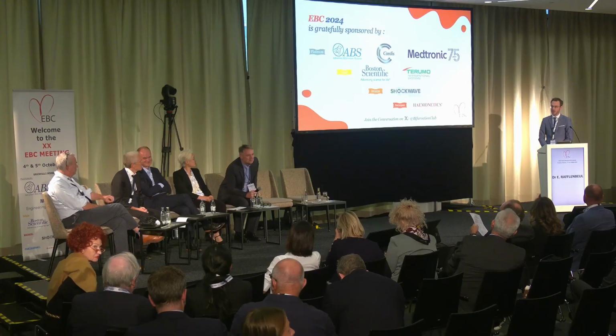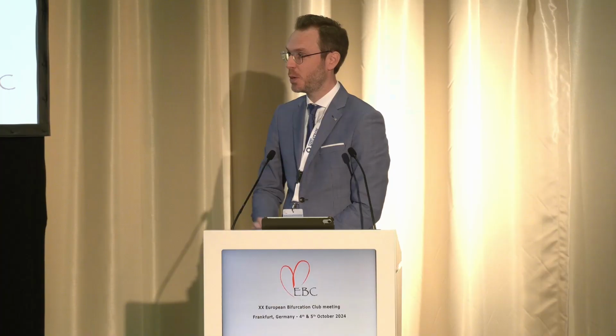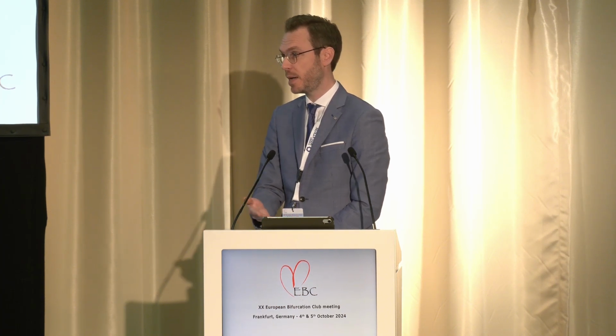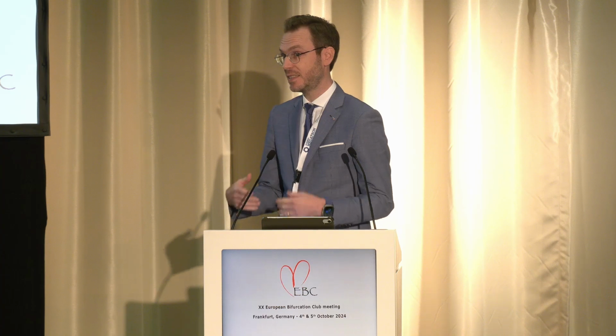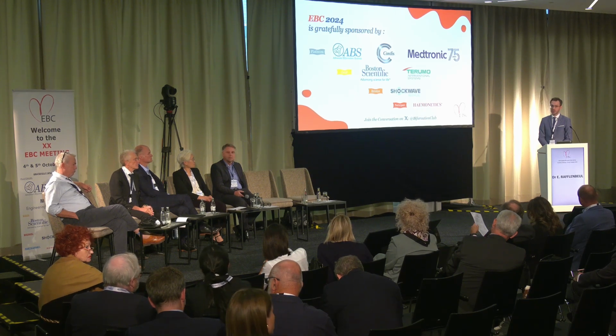So I don't think that we have to stent. We have data coming from the area from Eun-Seok, where we had a lot of dissections and the dissections heal. And this minor dissection, which is a type B, type 2 dissection, with no flow limitation, doesn't push me to put a stent inside, because the main approach of mine was not to put a stent in this patient, because after 2 weeks on dual antiplatelet therapy, he's able to get surgery after getting rid of the clopidogrel.